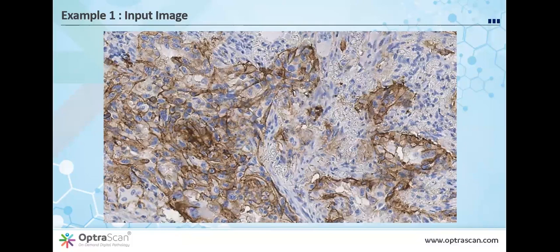Looking at the region, it looks like there's probably plenty of membrane, which indicates tumor positivity, and some blue cells, which may or may not be tumor. Well, when I say may or may not, that means there's a confusion. And why not? This confusion is something that a pathologist often experiences while scoring a PD-L1 slide. For me, I might score this region maybe 70% positive. Well, I'm not confident, but let's find out.